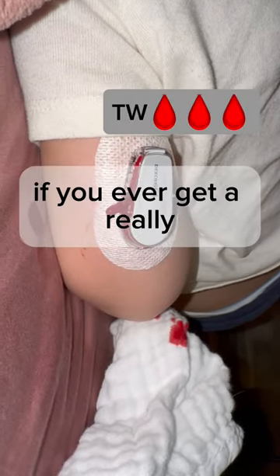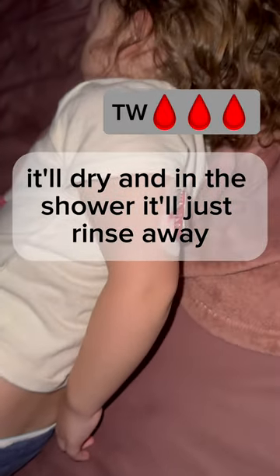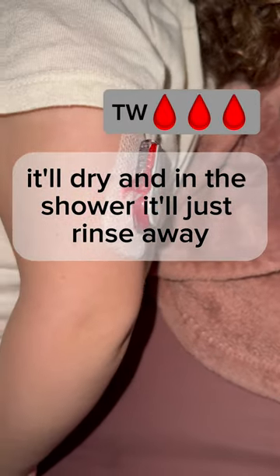So if you ever get a really bad bleeder, just know that it does stop eventually. It'll dry, and in the shower it'll just rinse away. No issue.